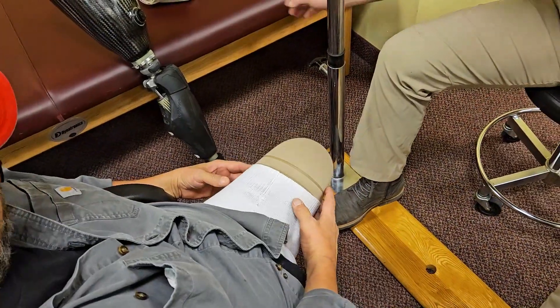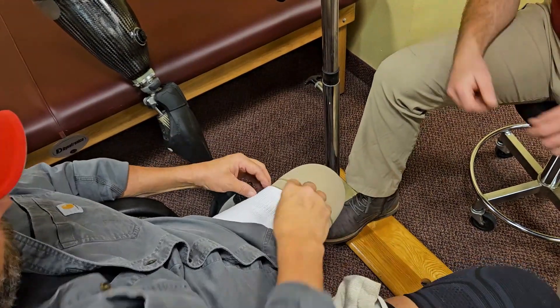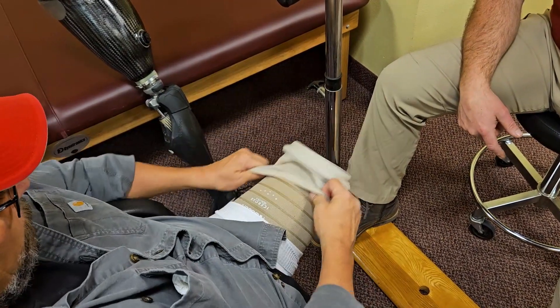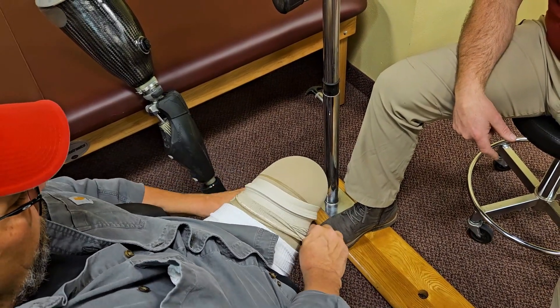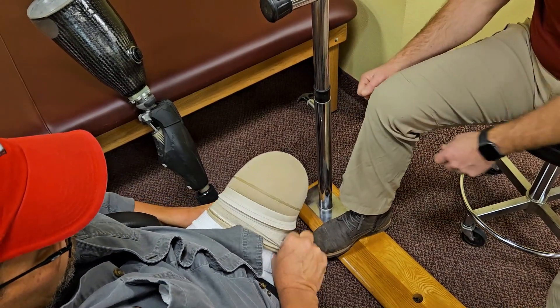We're going to take the seal-in ring. Fold the bottom of that sock up a little bit just to get it out of the way — that allows more freedom when you put the seal-in ring in. Remember, you can't have any material underneath the back ring. Then pull that fabric back down away from the ring.